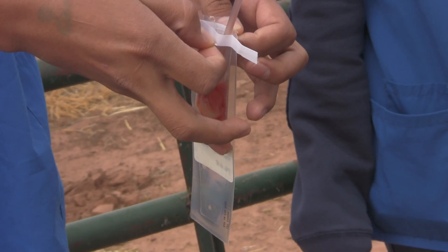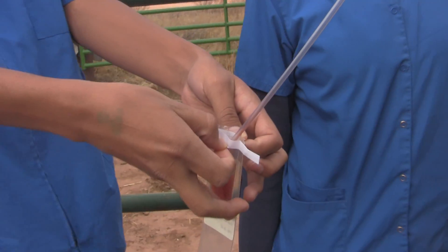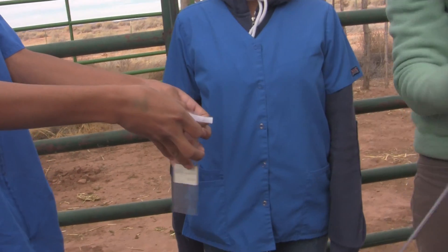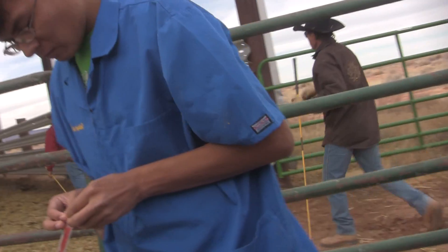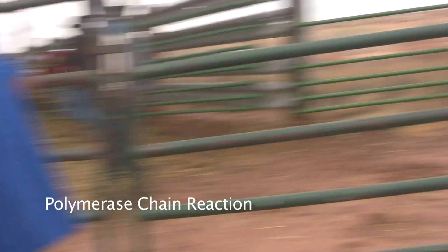Now we're introducing the sample into the pouch. The pouch is full of nutrients to keep the cells alive until they're able to be tested at the lab. Once at the lab, our lab here in New Mexico uses a real-time PCR. PCR stands for polymerase chain reaction — it's a way to multiply the DNA of the organism. If the organism is present, they will find it using PCR. It's a very accurate and sensitive test.